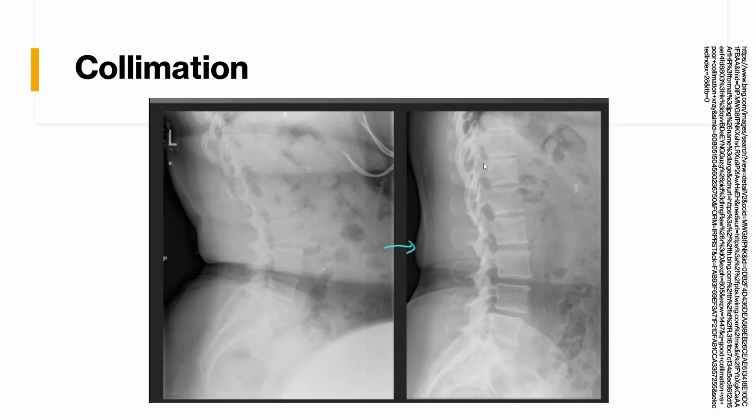So here's an example of somebody who wasn't collimated properly. This is a larger patient. We don't need to see a lot of their abdomen here because we are taking an X-ray of their lumbar spine. Note that the lumbar spine is front and center in the middle of the image. That's how we know it's definitely a lumbar spine X-ray, because that's where we put our central ray. However, you can't see really crisp boundaries of all of these vertebrae because of that decreased resolution from the lack of collimation. They also weren't gowned properly because they still have an underwire bra on.